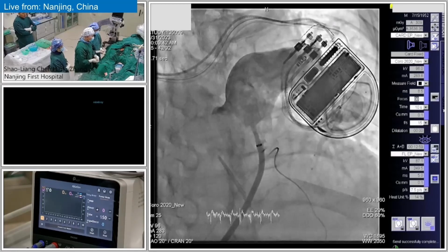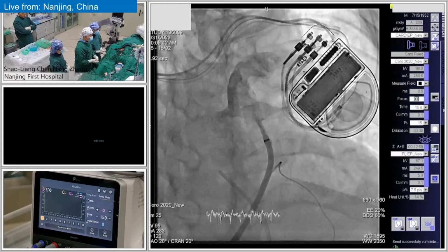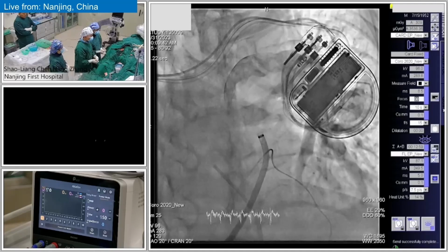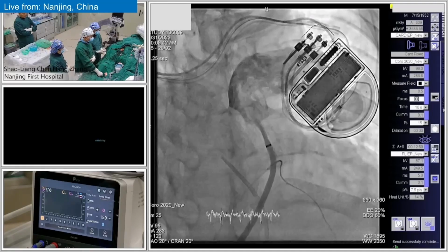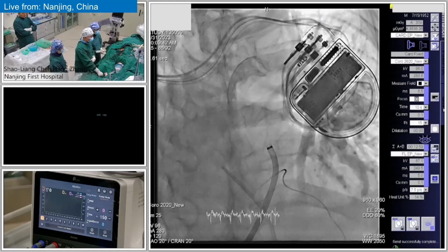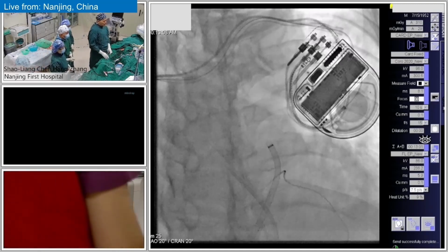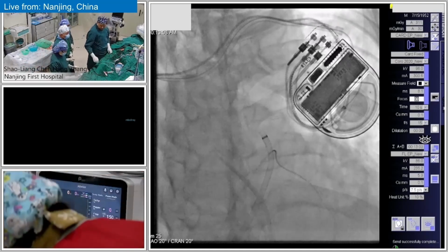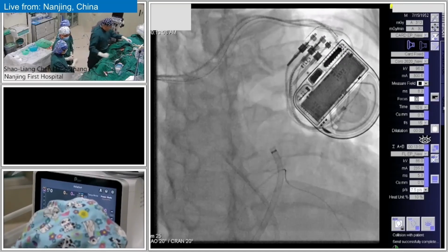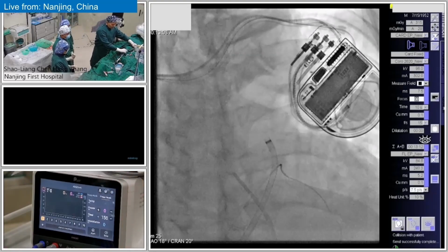The nerve trunk will bifurcate just at the distal bifurcation level, with one running around the anterior to posterior wall of the left branch, and another one localized at the posterior wall of the right branch. Right now we have finished the angiography for the pulmonary artery, so it is very clear that the Swan-Ganz catheter is just in the main trunk of the pulmonary artery.